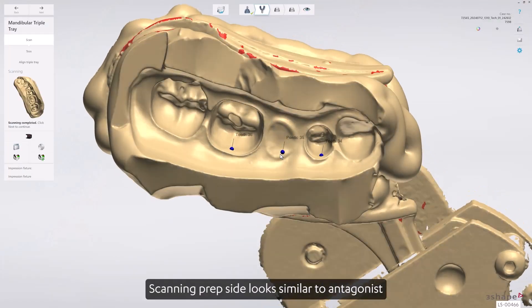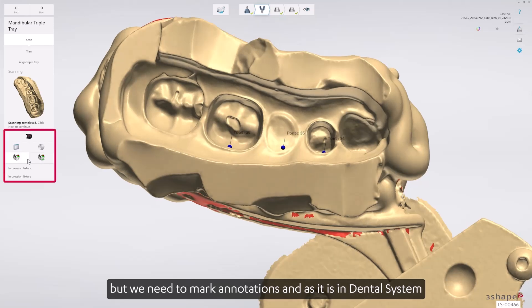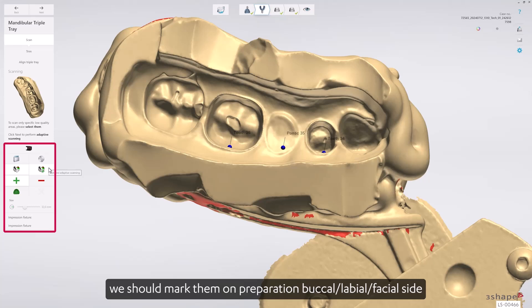Scanning the prep side looks similar to scanning the antagonist, but we need to mark annotations. As in Dental System, we should mark them on the preparation on the buccal, labial, or facial side, close to the margin line.